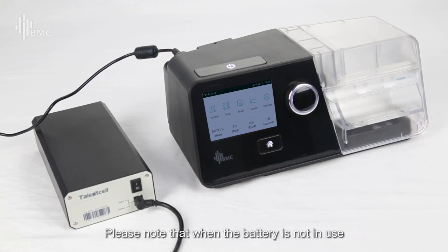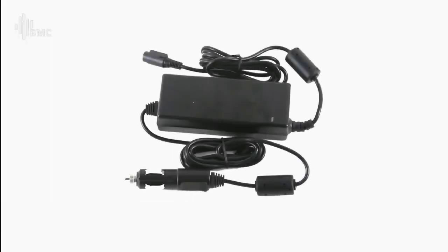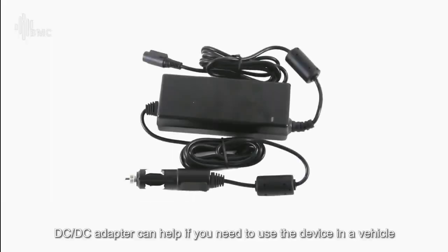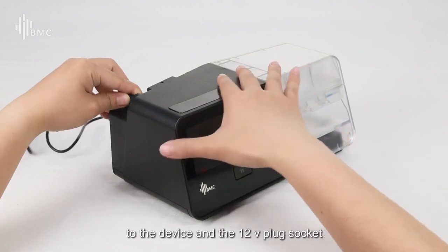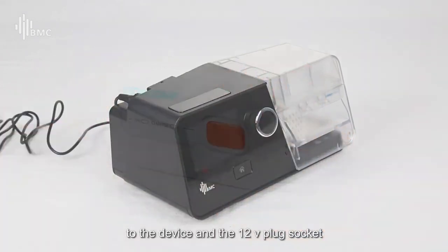Please note that when the battery is not in use for an extended period of time, it must be stored in a cool, dry place and charged at least every 6 months. DC-DC power adapter. For some drivers, the DC-DC adapter can help if you need to use the device in a vehicle. Connect the power supply plug of the adapter to the 12V plug socket.